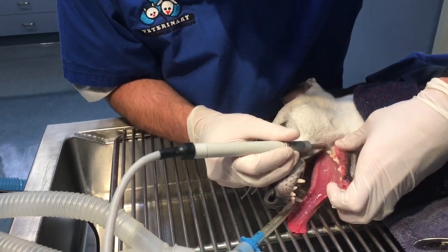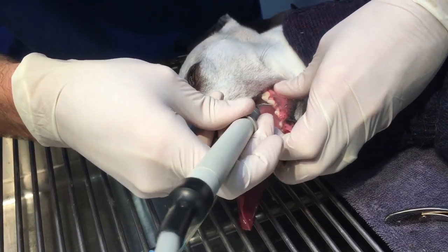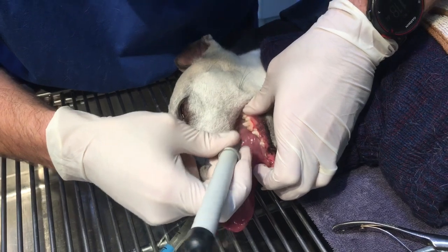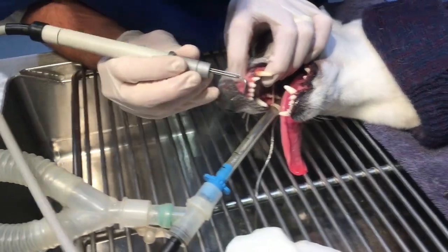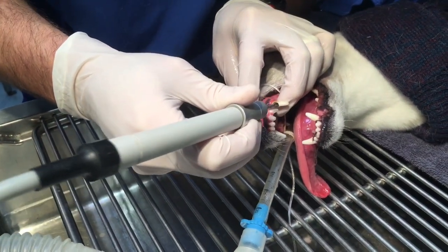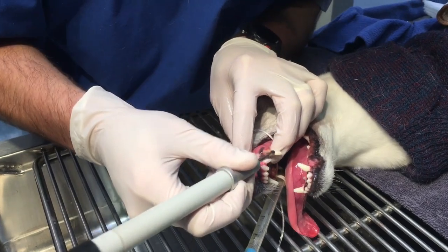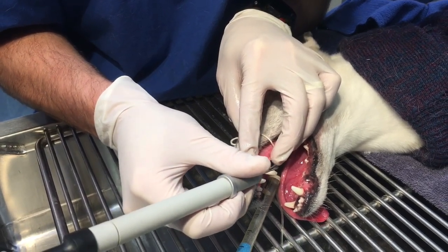Move in there and clear off all this tartar off this lower molar, and get around on the inside of the tooth too. We often see dogs with bad incisors if they like to chew their feet — dogs with allergies or fleas will often get hair caught around the roots of these teeth and get marked gum recession and marked infection. That's often where a lot of the bad smell comes from.